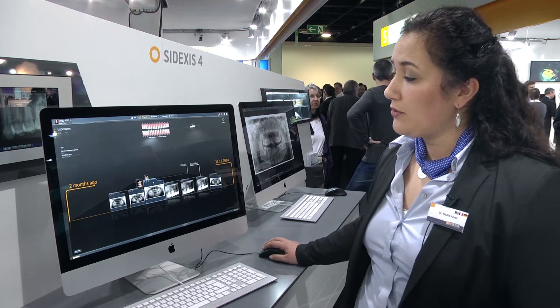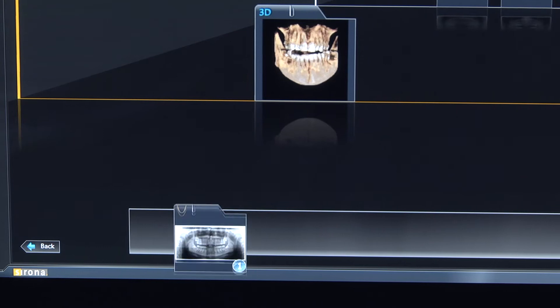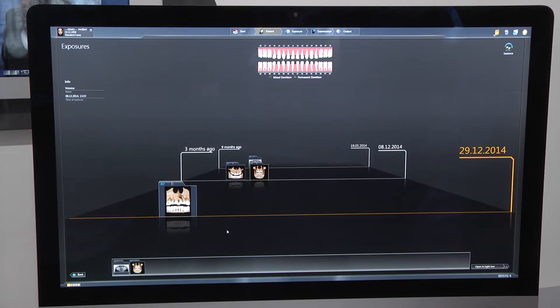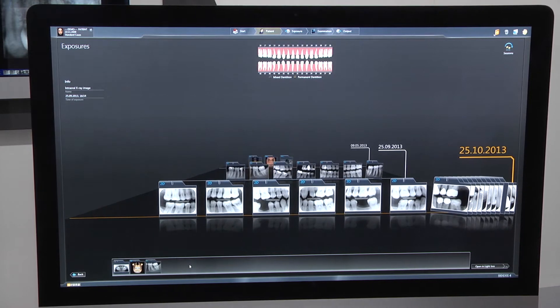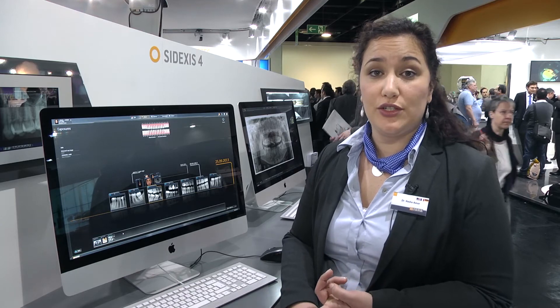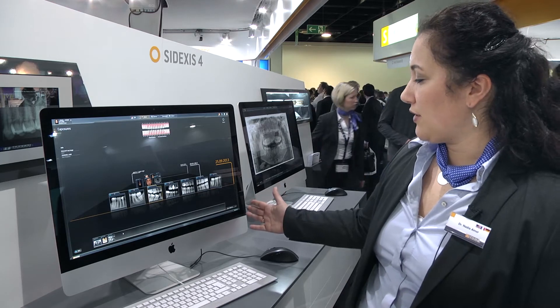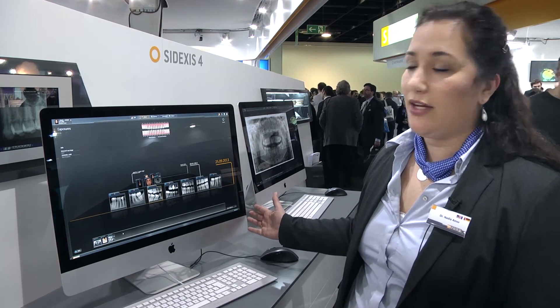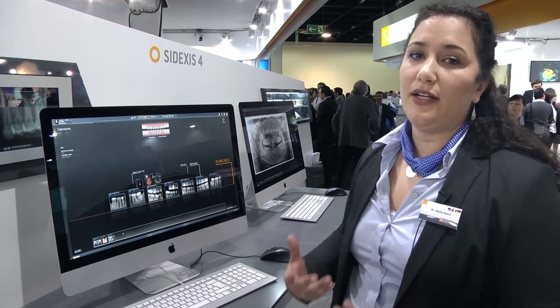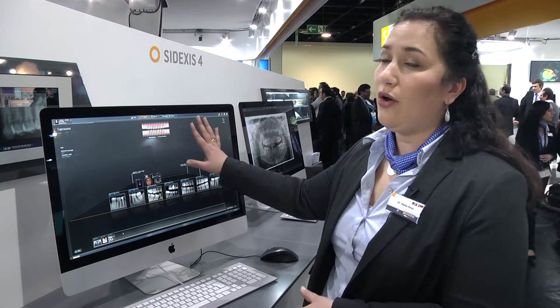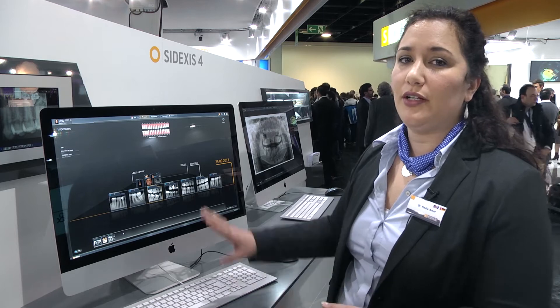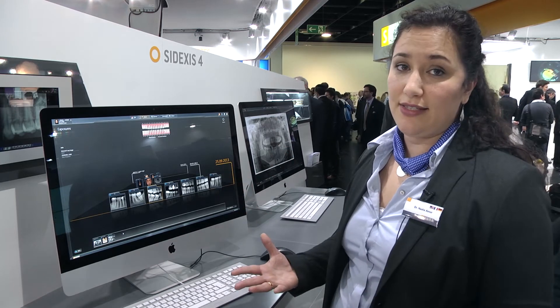If I want to make a selection of those images, I just drag them and put them in the little basket down here. You can see I can select any type — for example I now have a collection of a pan, extraoral 2D, intraoral, and a 3D scan. The software automatically suggests the next appropriate step, so you don't have to know every little detail of the software — you just use the next button and it's that easy.